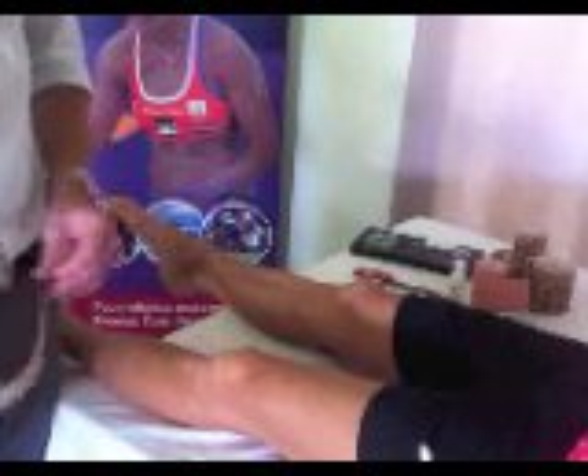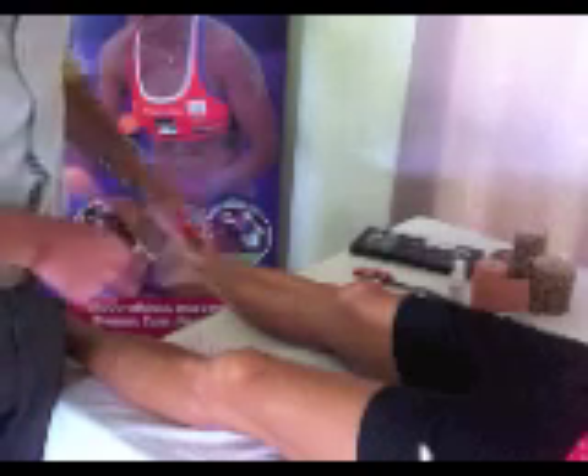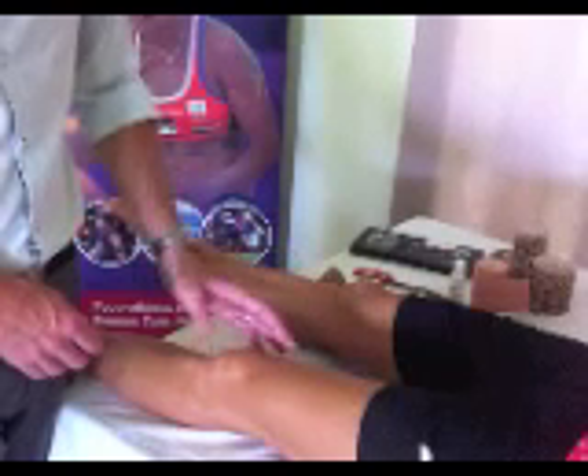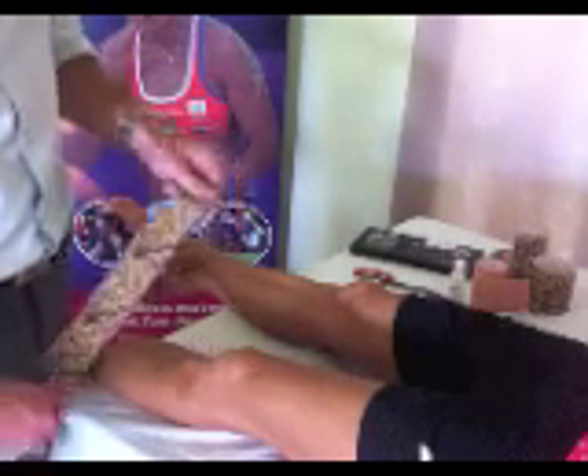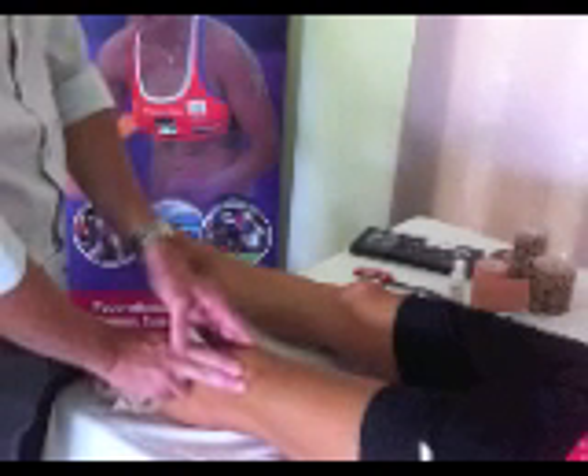This technique is a dynamic tape power band technique for patellofemoral pain syndrome or patellofemoral joint dysfunction, where the vastus medialis obliquus is weak or inhibited and delayed medially, while relatively tight laterally, causing lateral tracking of the patella. We're going to use a power band made by laminating two layers of two-inch or five-centimeter dynamic tape together to provide a sling and resistance to lateral translation of the patella.